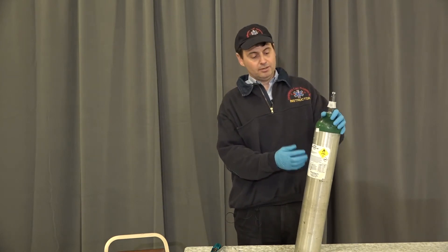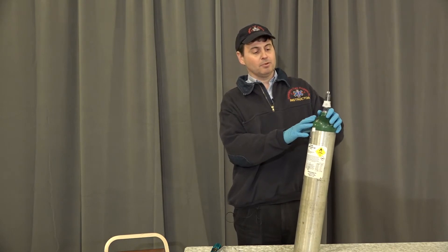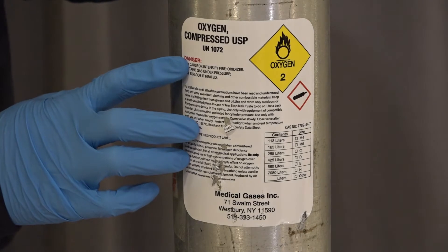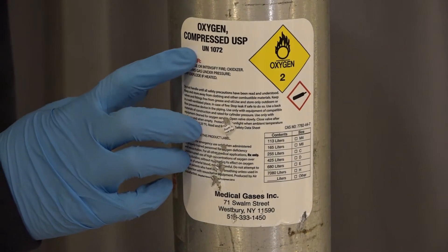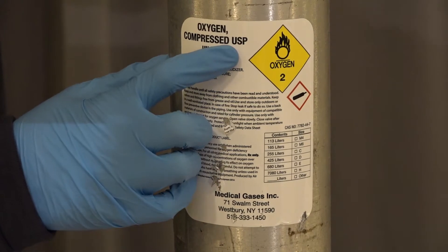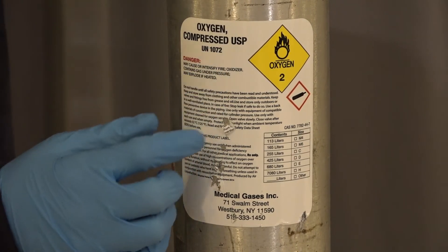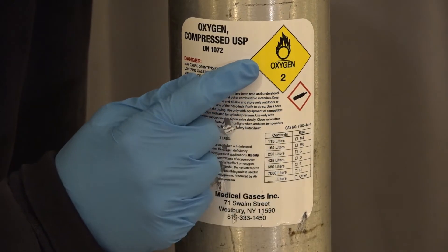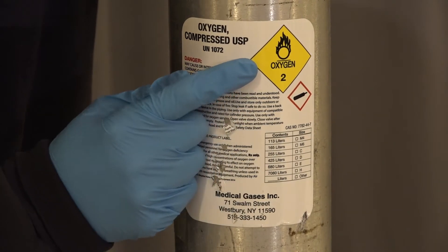We're going to identify the oxygen tank — a silver tank with a green top, green symbolizing oxygen. We're looking at the label on the oxygen tank to identify it as oxygen and medical grade oxygen. We have the word oxygen, and USP stands for United States Pharmacopoeia. We have the yellow oxygen symbol indicating that the oxygen supports combustion.